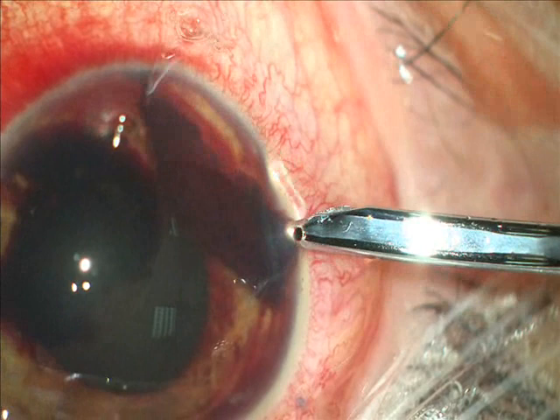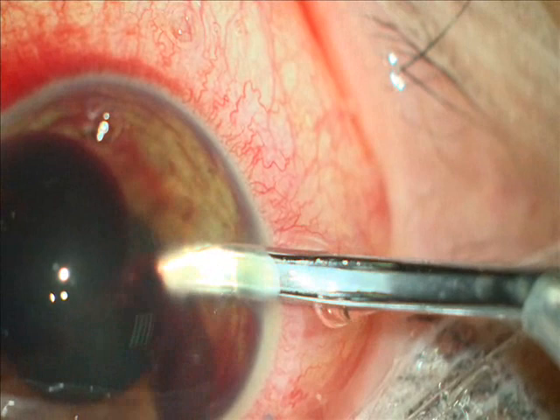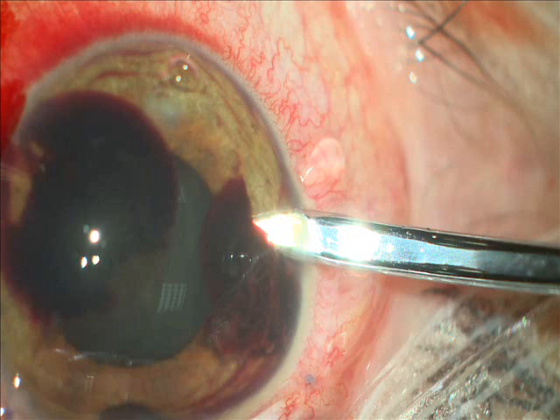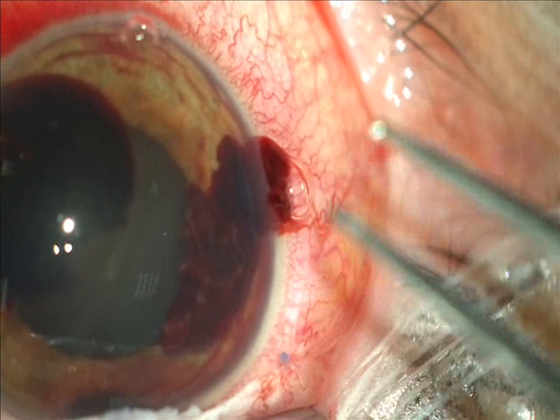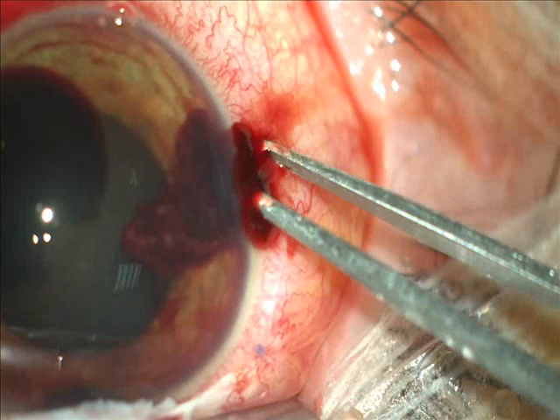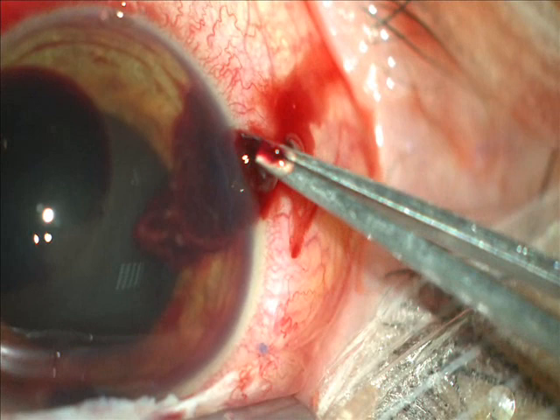The previous short video showed the moment of the Descemet's detachment from Healon, but the next day it was not a simple detachment of the Descemet in the periphery, but a greater one threatening the central vision and the visual axis with blood. In eyes with very advanced glaucoma there tends to be post-operatively blood and hyphemas in the anterior chamber.